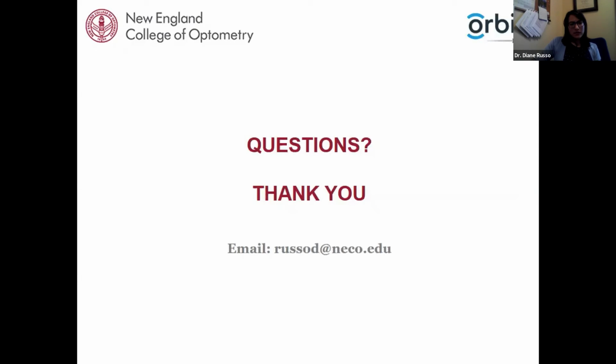So let's see, if the cylinder is say -4 on retinoscopy and the autorefractor, and the patient doesn't accept more than 2.5 diopters, what would you prescribe? I always have questions for the questions. My question would be, what do you mean by doesn't accept more than 2.5 diopters? Does that mean they're not comfortable in more than 2.5 diopters of cylinder, or when you're going through the power refinement, they don't take any more than 2.5 diopters?